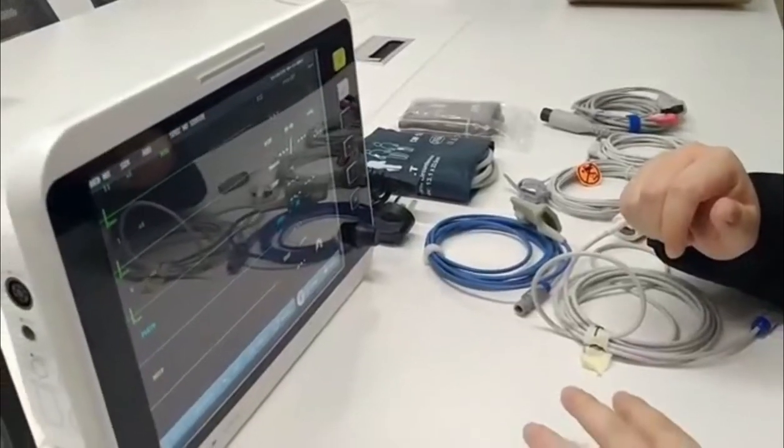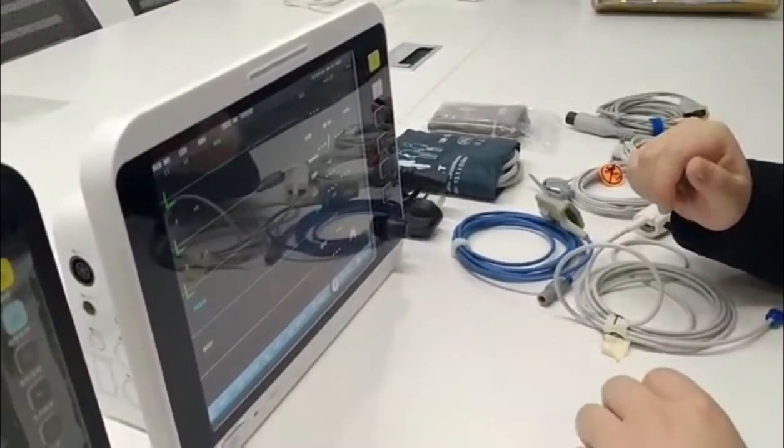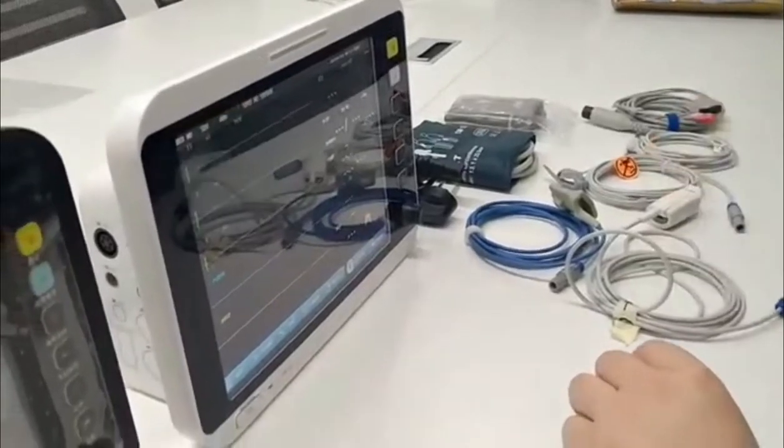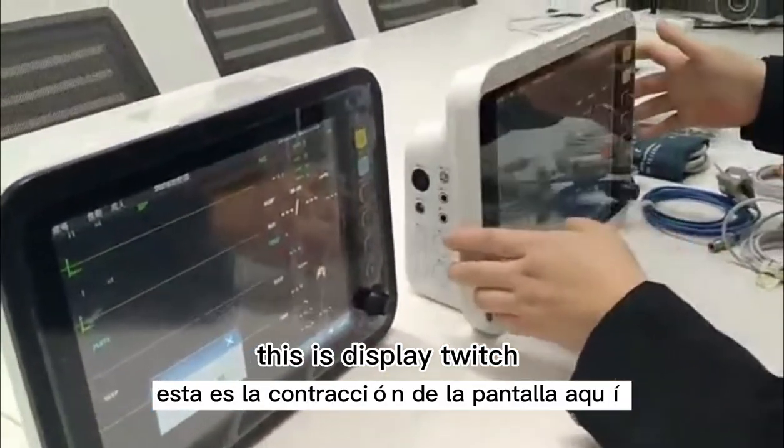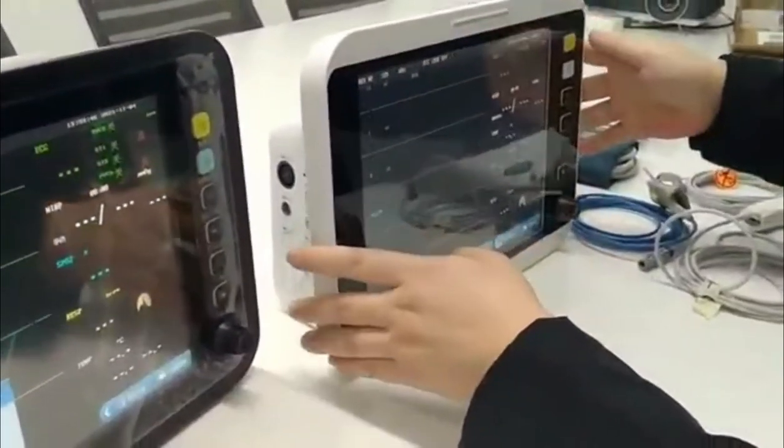Hello friends, this is to introduce the 12-inch caption monitor. This is model 2, 12-inch. We will use this machine for the demo.